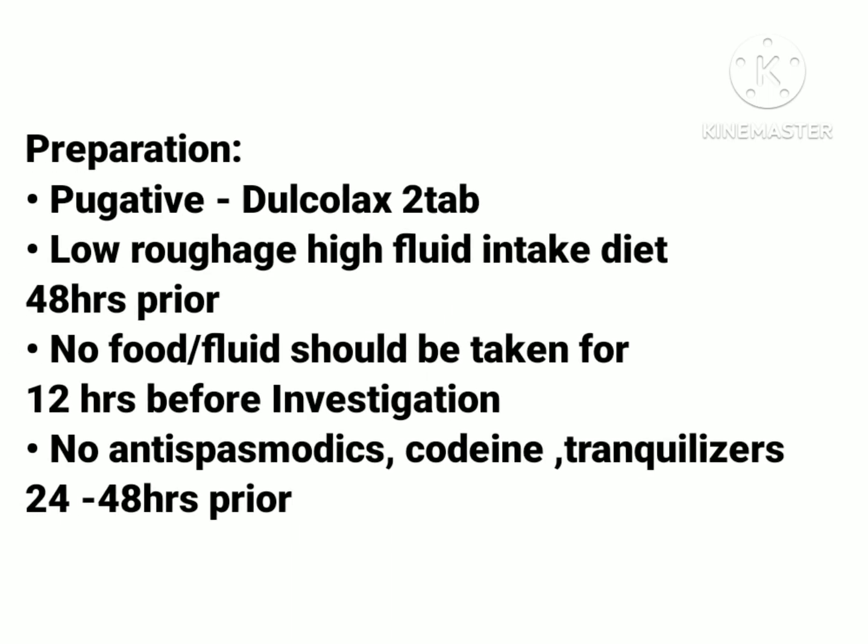There are some preparations that must be done by the patient before going through this procedure. The first preparation is that the patient is told to take strong laxatives, means medicines, and mostly we prefer Dulcolax laxative, that is given 2 days prior to the examination, and this medicine helps in easing the passage of fully formed fecal matter from the rectum.